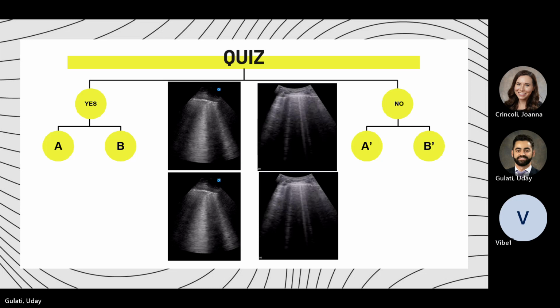Yep. Okay, so it's lung sliding. Now, is it an A profile or B profile? B. Yeah, because you see these, and I wouldn't even say B prime, I would say more like a B profile, right? You see good lung sliding throughout. You see these straight, homogeneous, clear, demarcated rocket lines that go all the way down. This is textbook for what? What's your diagnosis?